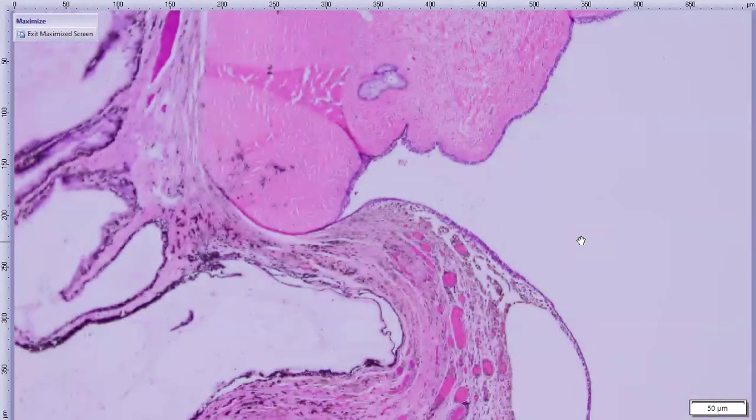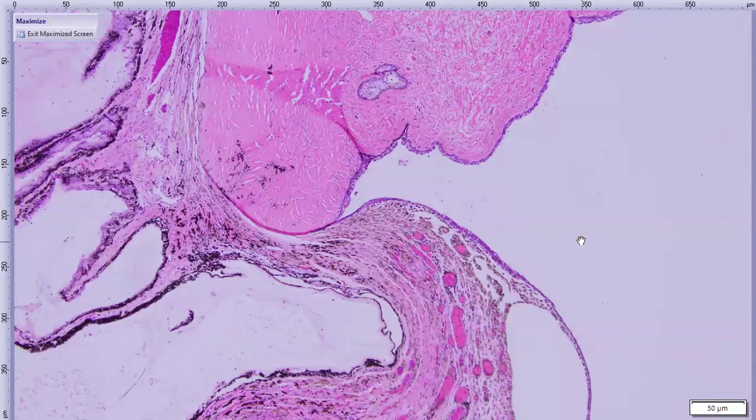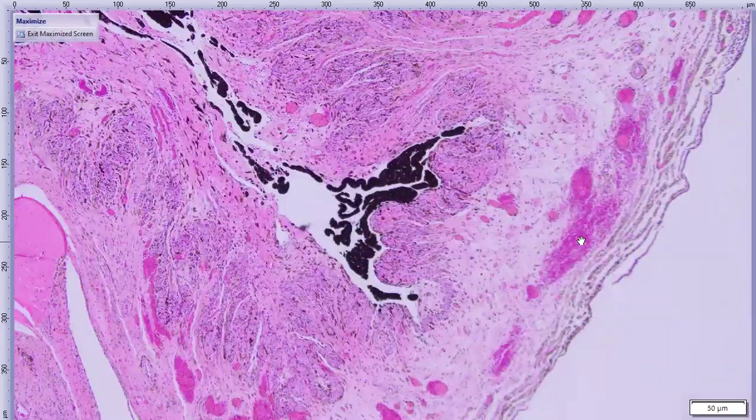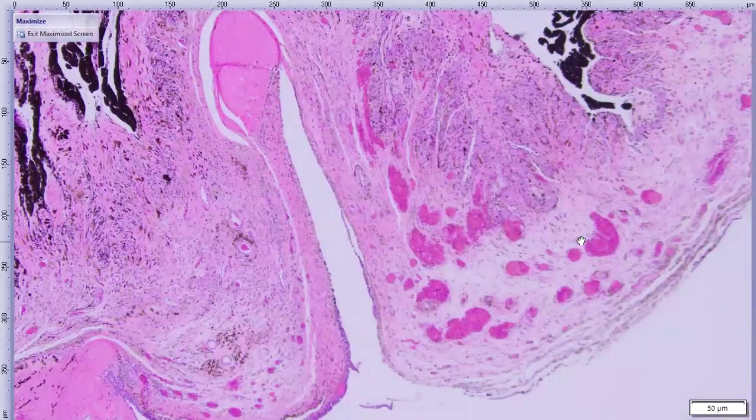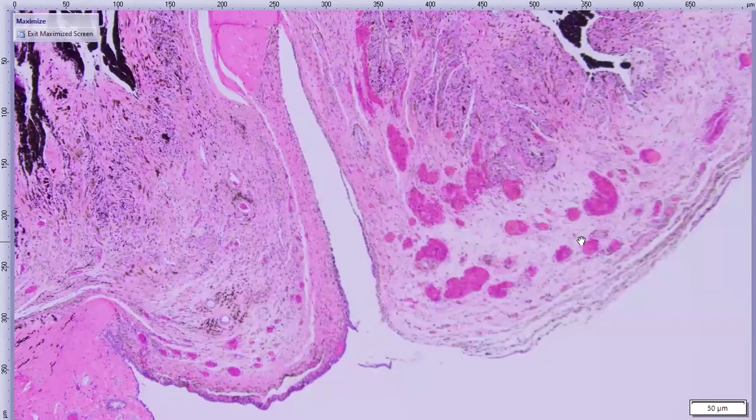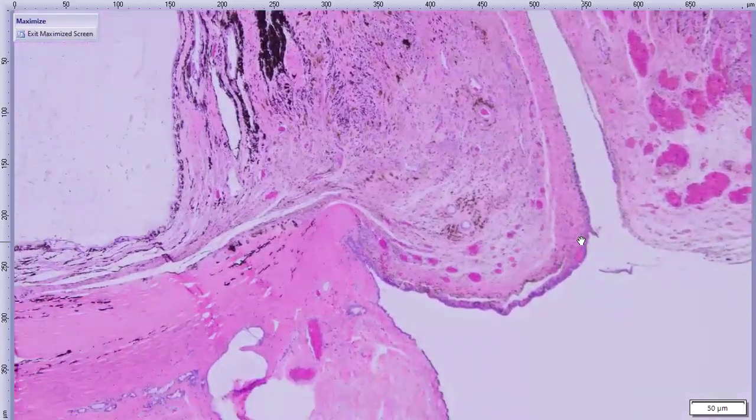So essentially, corneal epithelium will heal by sliding over surfaces. And you've got these limbal stem cells at the limbus, which help to replenish that epithelium. Especially if you have some exhaustion of those stem cells, or possibly symblepharon, you can end up with a conjunctival phenotype of that epithelium on what may have been the corneal surface, or what is the new corneal surface in this case. So we have conjunctivalization of the cornea, if you can call it that at this point. And you have reepithelialization overlying this prolapsed iris. The cornea itself really is broadly absent in this case.